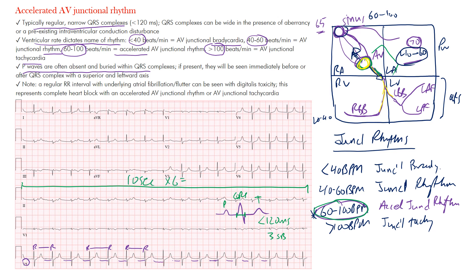To calculate the rate: the standard 12-lead EKG is 10 seconds, and 10 seconds times 6 equals 60 seconds — one minute. Count the number of ventricular complexes and multiply by 6. Counting here: 1, 2, 3, 4, 5, 6, 7, 8, 9, 10, 11, 12, 13, 14, 15, 16 — so 16 times 6 is about 96 beats per minute, which is between 60 and 100, though close to junctional tachycardia.